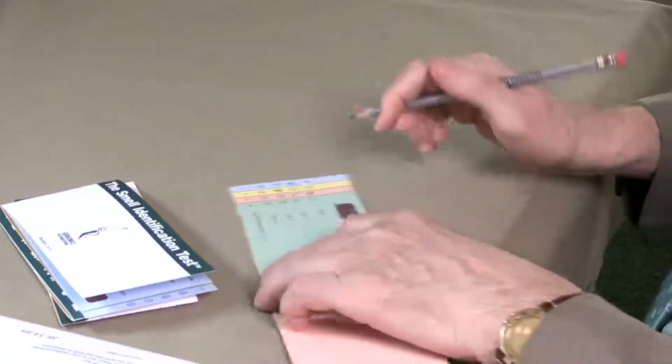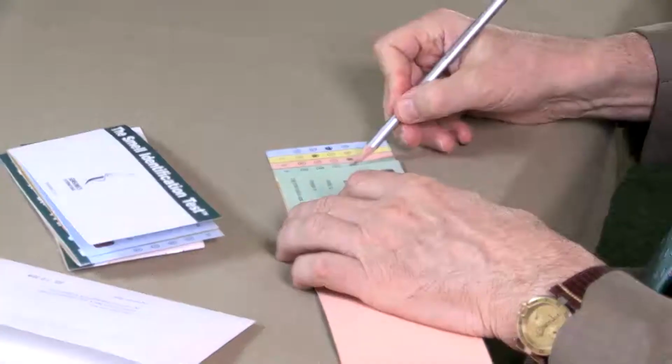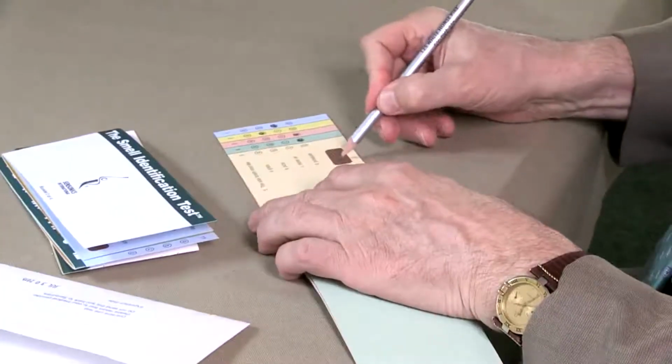Does it smell most like tomato, licorice, strawberry, or menthol? Menthol. Menthol, okay. Smell most like whiskey, honey, lime, or cherry? Cherry. Does it smell most like grass, pizza, motor oil, or pineapple?